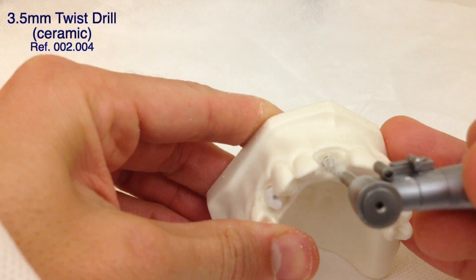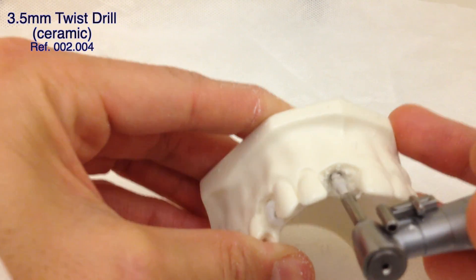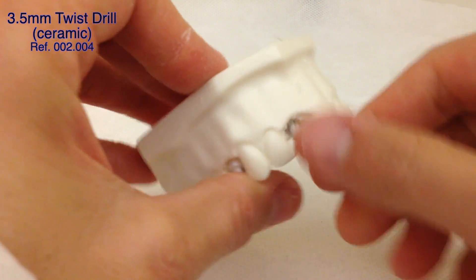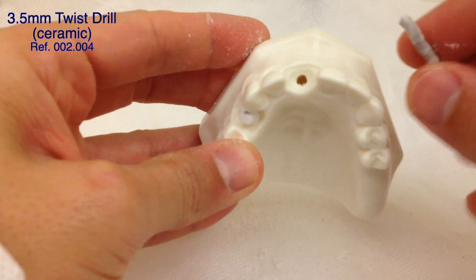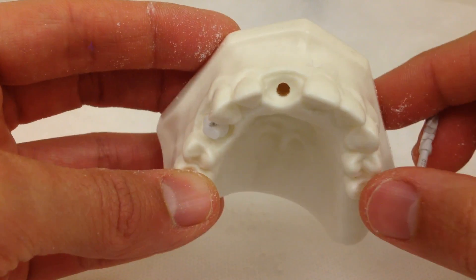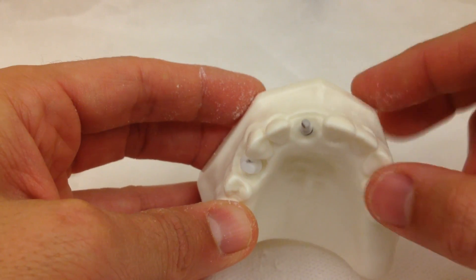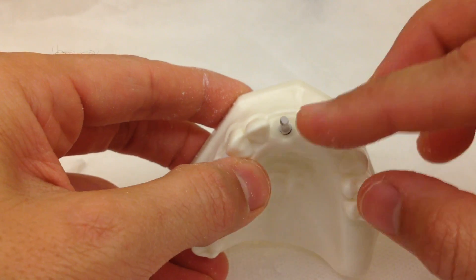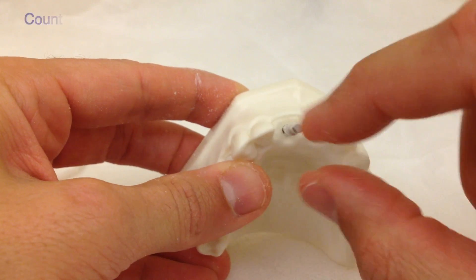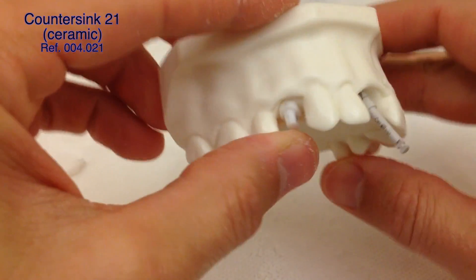We can drill slow and collect bone particles if we need to make some grafts, or use standard drilling at 800-1200 RPM with plenty of irrigation. We're getting close to the 14 millimeter line. We can see that we're still in the center of the socket with the same amount of bone on the buccal as on the palatal, and the 3.5 drill is in the center of the incisal edge. If for some reason the drill does not follow the incisal edge and we see it going more buccal, we have to correct the direction using this drill or the one before, changing direction to follow the incisal edge.